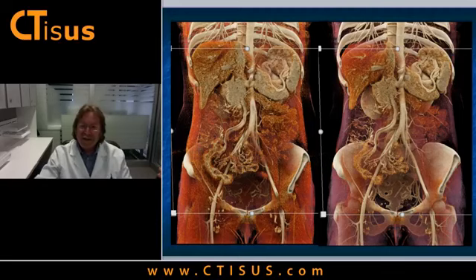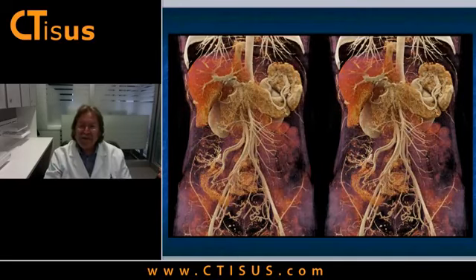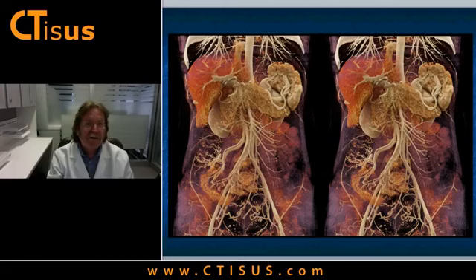And then one last set of images, again, changing the parameters. This is a nice visualization, right? Up high, you see the liver, the spleen, the pancreas, celiac and SMA to the ileocolic vessels, the prominent enhancement of the patient's ileum, consistent with active Crohn's disease, and also some of the vessels into the pelvis and some of the bowel in the background. So those are 3 cases which probably provide a good idea of what we're talking about.